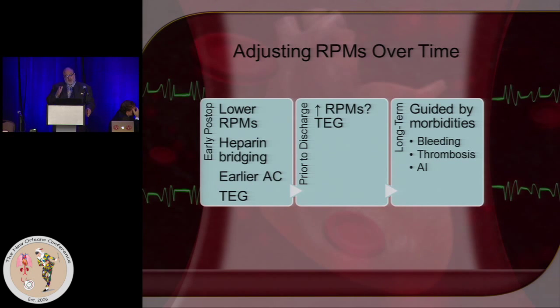The phenomenon also occurs when we adjust the RPMs over time. What we do in the early post-op period, what we do in the late post-op period, and what we do once the patient is going home. And all of these are in evolution.